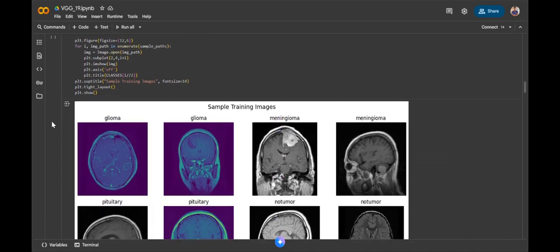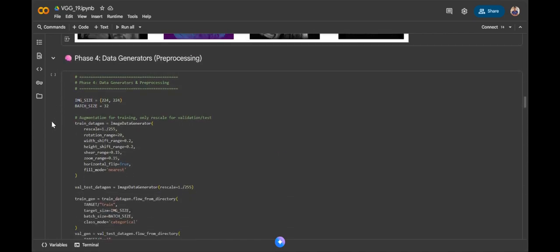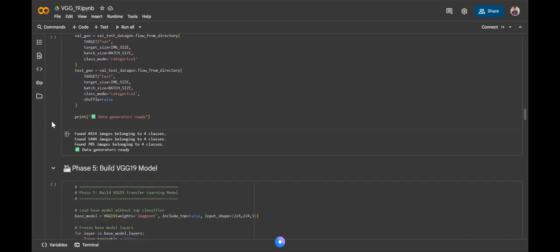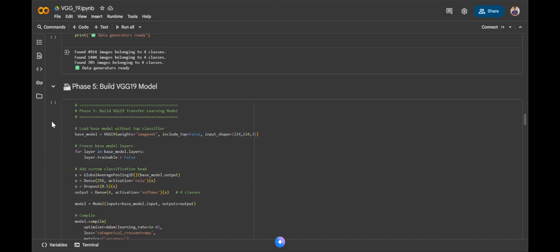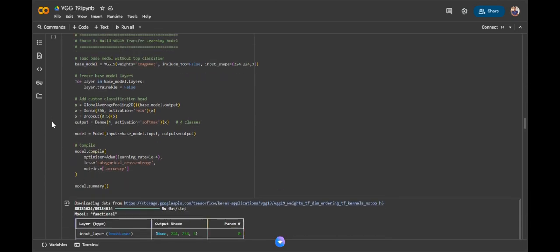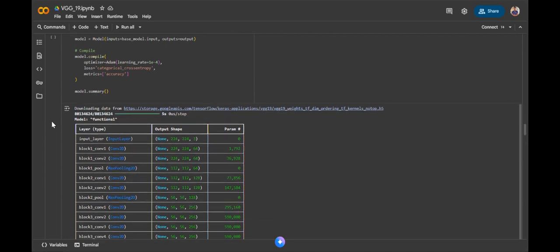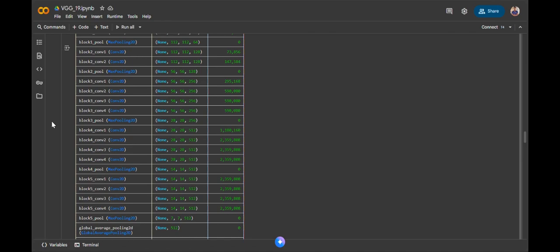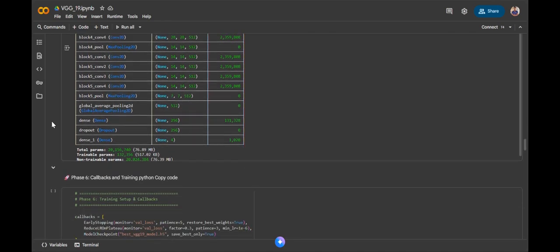To conclude, our project successfully demonstrates the potential of deep learning in the field of medical imaging. By leveraging CNN, transfer learning models, and YOLO architectures, we explored how AI can contribute to faster and more accurate tumor detection. In future work, we plan to expand our system by incorporating 3D MRI analysis, where multiple slices of a brain scan can be processed together for improved context understanding.